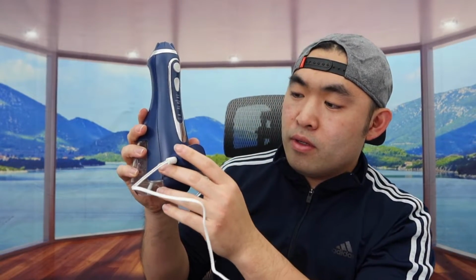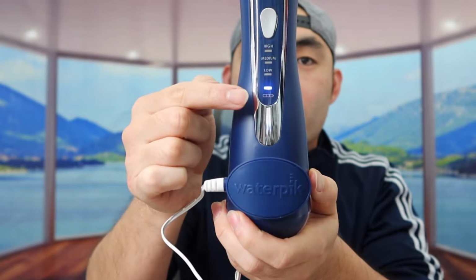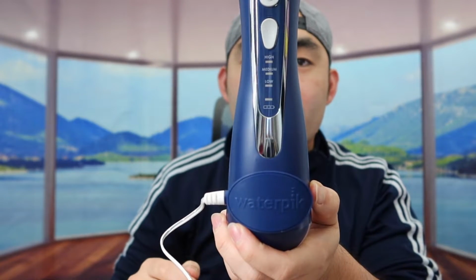So I want to take out the cover right here first. Once you guys take it out, you guys can plug in the cable. Once you guys do plug in the cable, you guys can start charging it. And where you guys want to put this is right here. So you can see how once you guys put it right there, it starts charging. So that is basically how you guys know when it's charging.